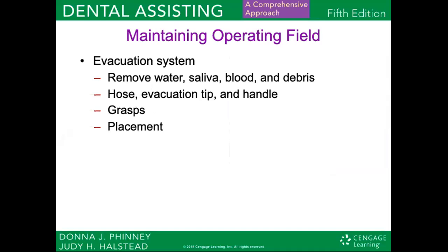The evacuator system is designed to remove fluids and debris from the oral cavity. The cool thing about the evacuator system is that it can remove lots of debris very quickly and very forcefully. A lot of the time the blood, saliva, and debris from a drilled tooth or drilled teeth will flow into that evacuator.